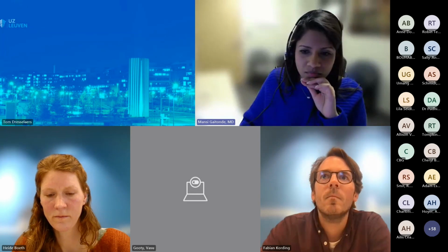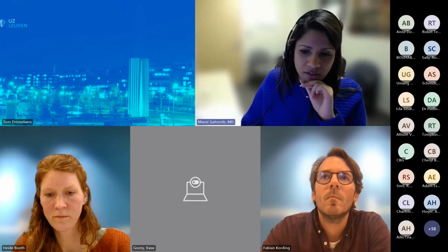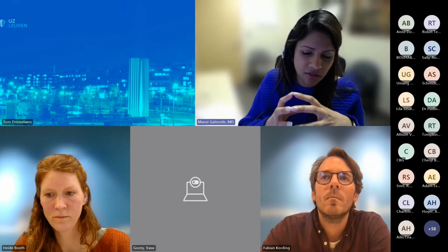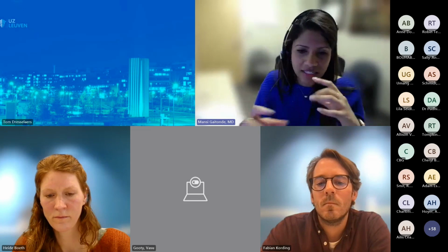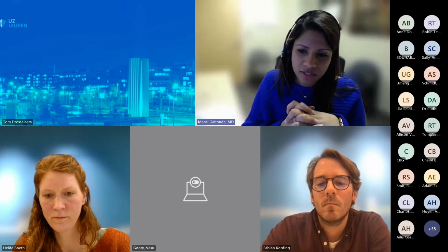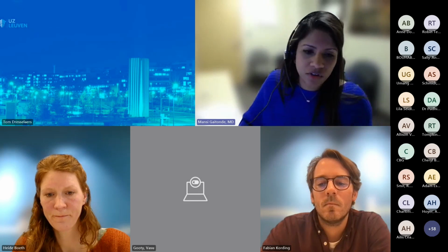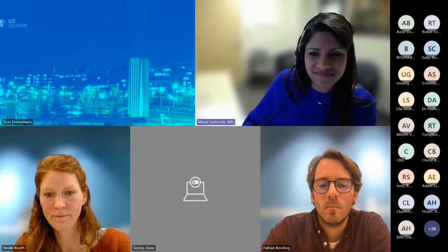And I think we have to be a little cognizant of the future, in that maybe we do need to focus more on imaging the whole heart, because I do think this has been a problem. We think we're getting the right slices and the baby moves, and so that's been a bit of a challenge. But I'm happy to send over our exam card if you just CC me your email. That'll probably be easier.